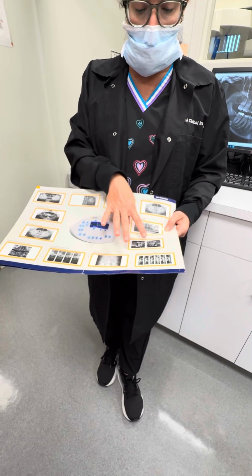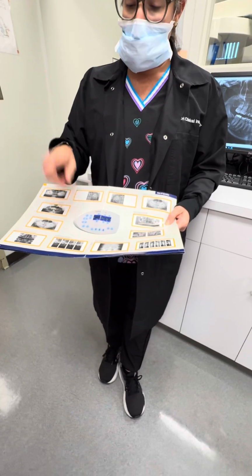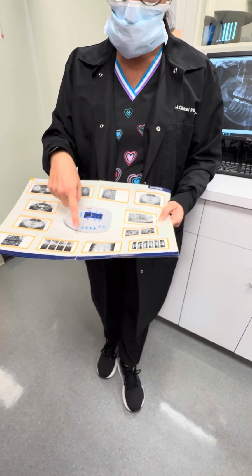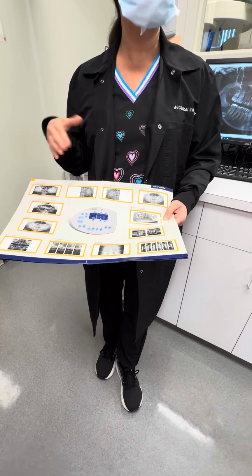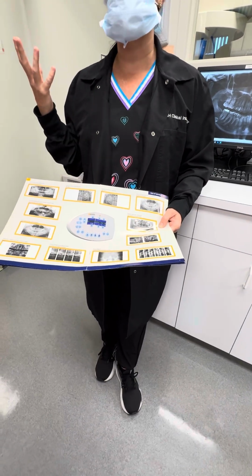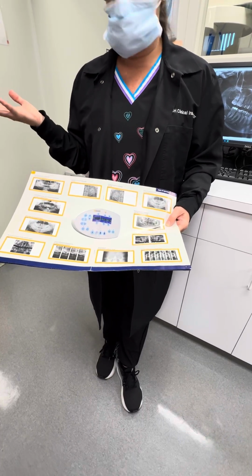So the BW1 is the posterior, right and left. The BW2 is just the anterior and it goes all the way back to premolars. Then we have the TMJ, so you can actually see like the coronoid process there. And then we also have, this was the one I forgot to tell you guys about, we actually can see a picture of the sinuses. So remember when we were talking about if somebody had like a sinus infection, they're having pain in their teeth, nothing's wrong with their teeth, then at that point we could do one of these sinus views to check and see, okay, is there something going on in their sinus cavity?